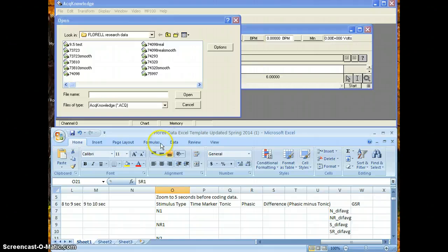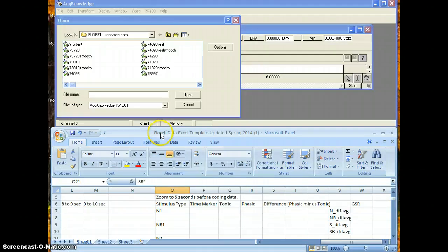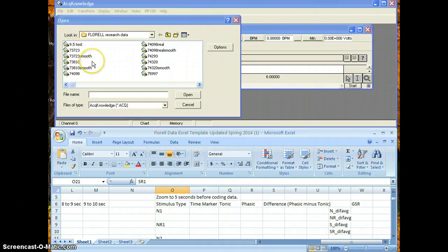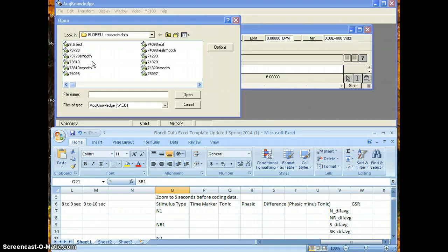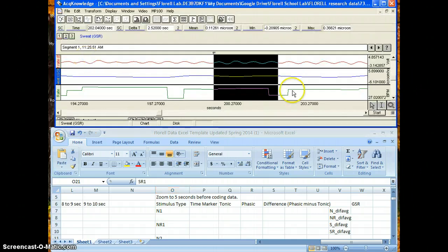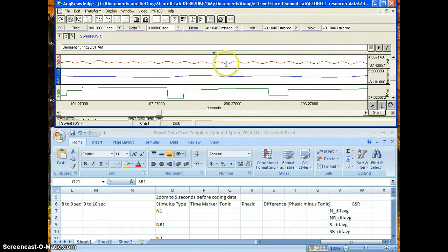So you need to make sure that the participant number on the Excel file and the participant number on the AcKnowledge file matches. It's really important that you make sure they match, and you're going to want to make sure you open the smooth AcKnowledge file. Okay, so we need to get rid of that.